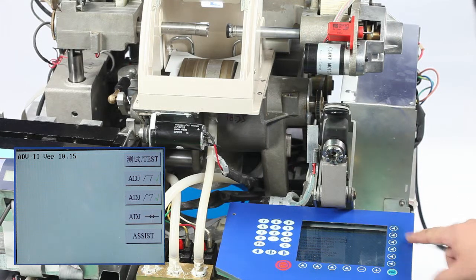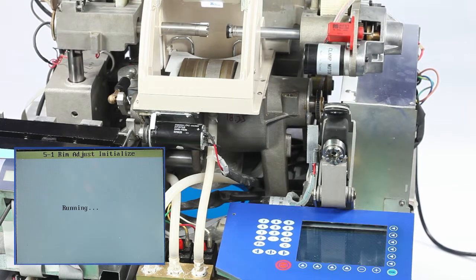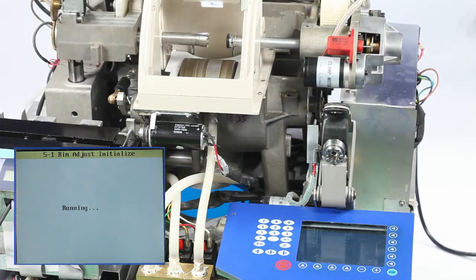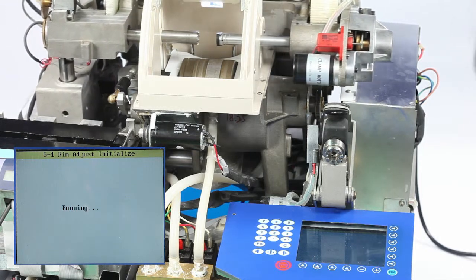Choose the second option on the testing interface and enter the rimless calibration initialization. Choose Yes, then enter the clamping force calibration interface after the machine self-inspection.